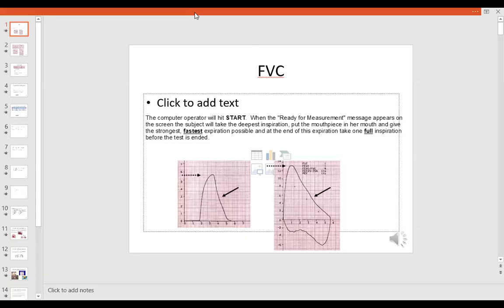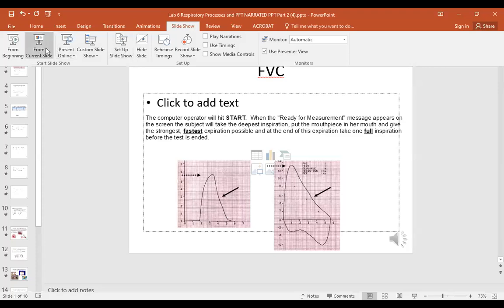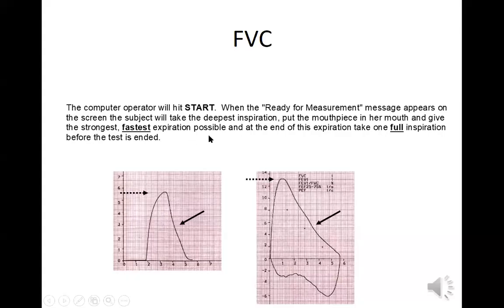Any questions so far? Again, know the units. Know what the test looks like, what the difference is between the capacities and the volumes versus the SVC, MV, and which other one do we see? MVV. And they're all in your book. Pretty straightforward, actually.